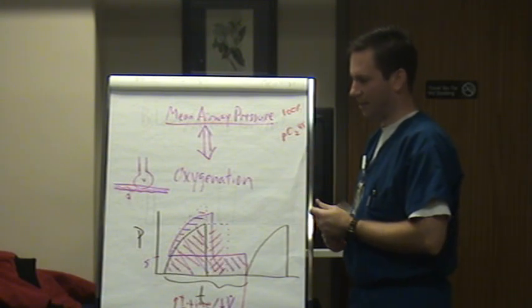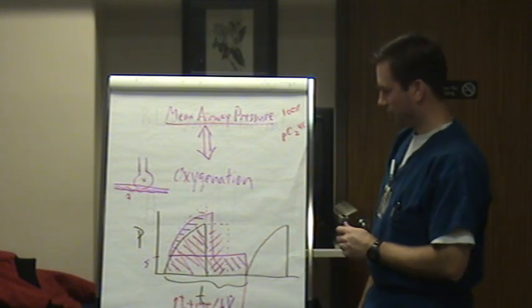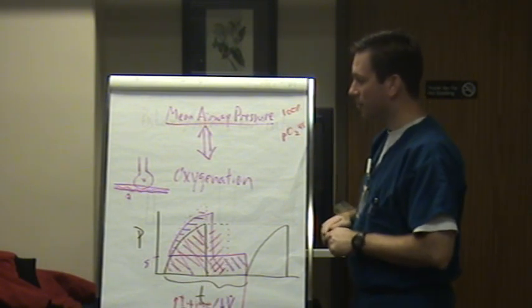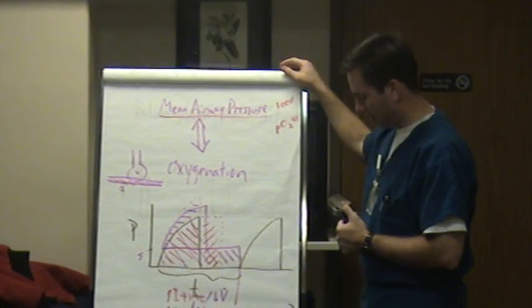Some patients can't handle it, and for that reason, if they don't get fluid, they're definitely not going to be able to handle it. But your therapist will usually be able to tell you if they need more or less PEEP, because they can look at compliance. And when the lung becomes so sick that all we're trying to do is oxygenate them, we do a lot of times do permissive hypercapnia, at least on 7th floor.